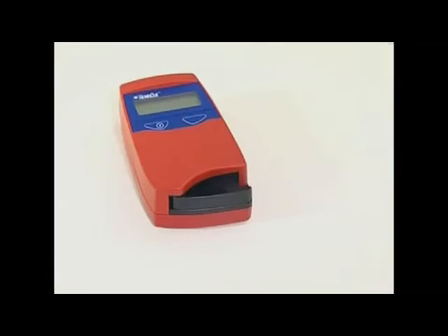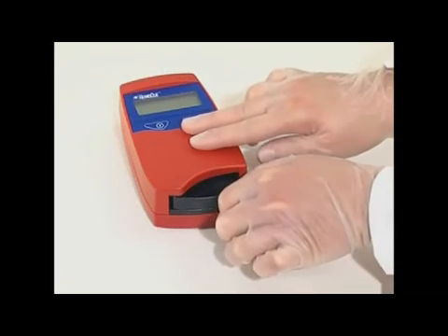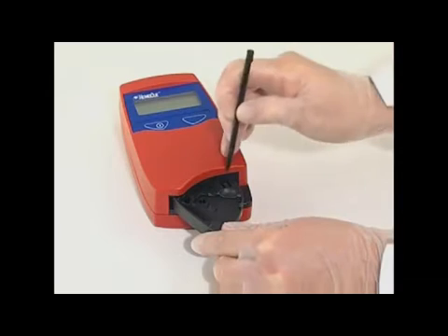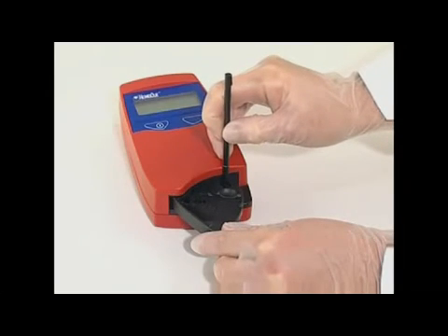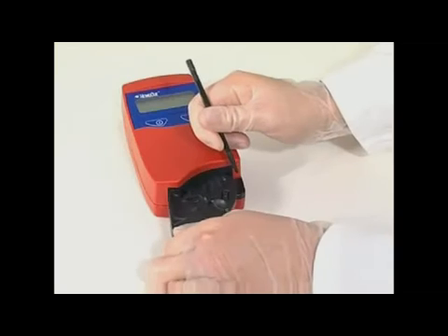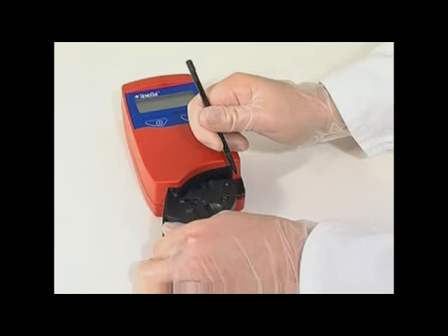Rotate the cuvette holder out to its loading position. Use a pointed object or your thumb to carefully depress the small catch positioned in the upper right-hand corner of the cuvette holder. Whilst keeping the catch depressed, carefully pull the cuvette holder in the direction in which the handle of the cuvette holder is pointing.